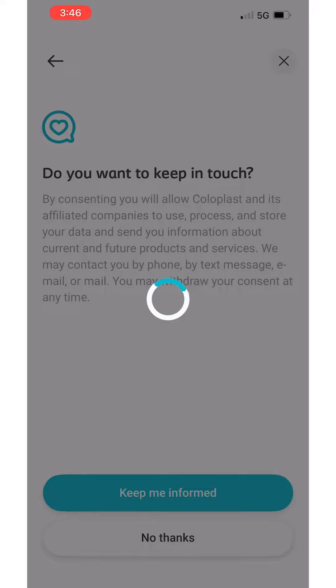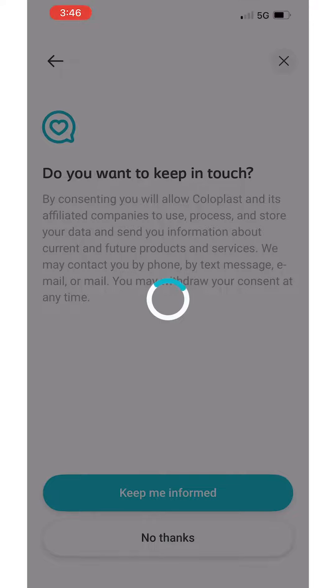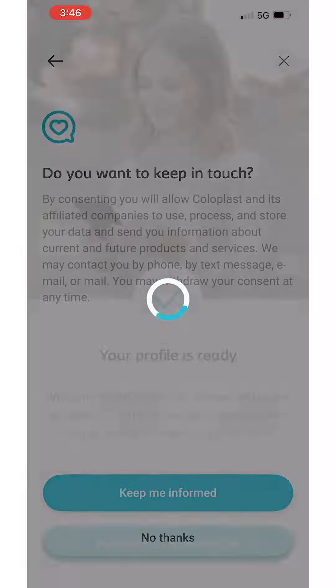Step 5. Your My Ostomy Life account is now created. Only a few steps to go to personalize your experience. Click Personalize My Ostomy Life.